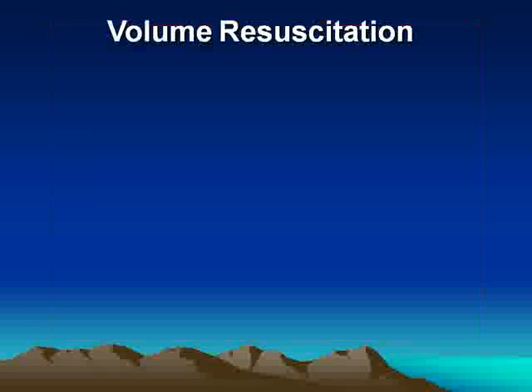Now this simple test can be done as often as we like. But supposing this child was overloaded, when we raise the legs, we would increase the overload further and his stroke volume would decline. Well, that's no big deal. We just put the legs back down and we're back to where we started. No harm done. Now let's offload the patient. So this very simple test, along with continuous stroke volume measurement, gives us the answer to where we are on the Starling curve.